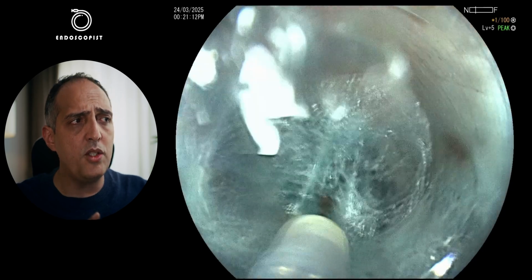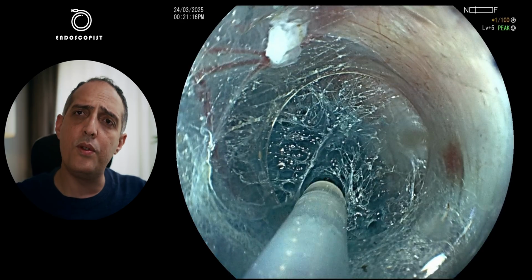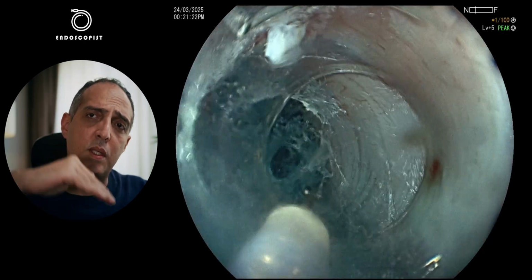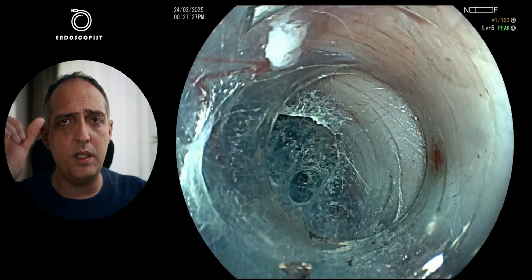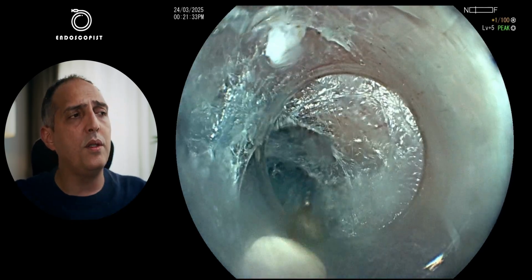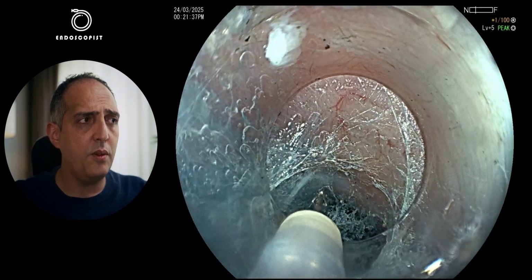So again, regarding the measurements, the cardia was at 45 centimeters. So I want to do about 12 to 14 centimeter myotomy. At least 10 to 12 centimeters will be above the cardia. That's why I started the incision at 30 centimeters. I will start the myotomy at 33, 35 centimeters, and I will prolong the myotomy about 2 centimeters below the cardia. Again, as you can see here, we cut very smoothly.